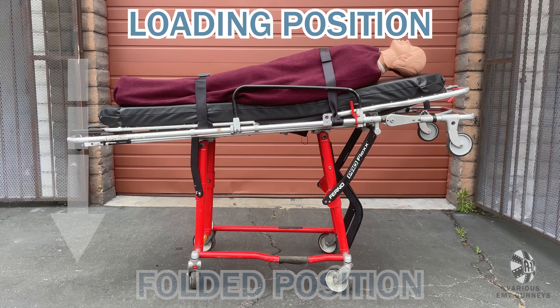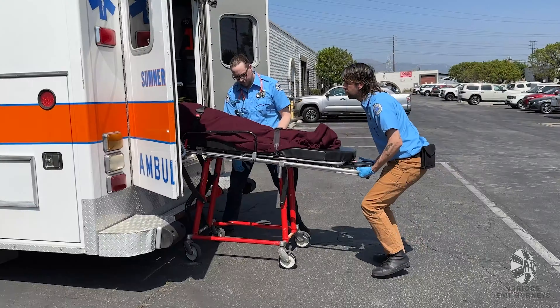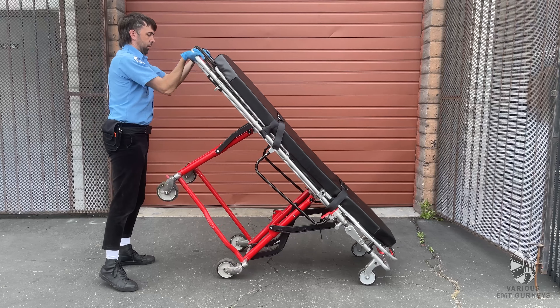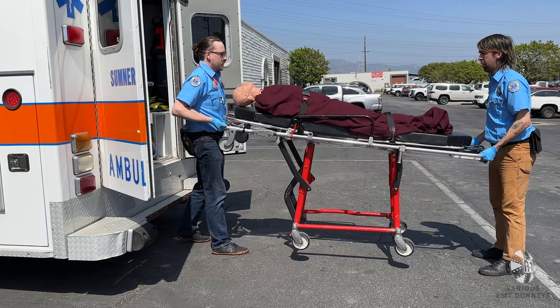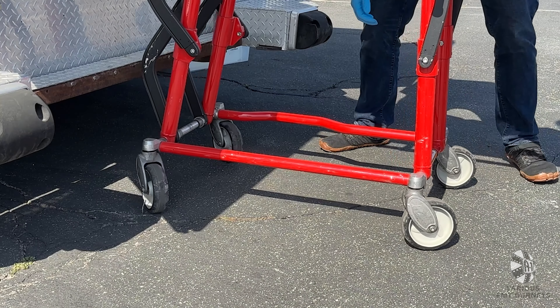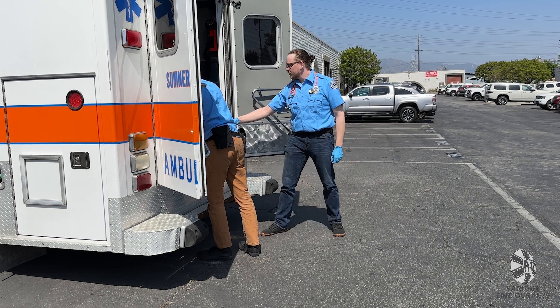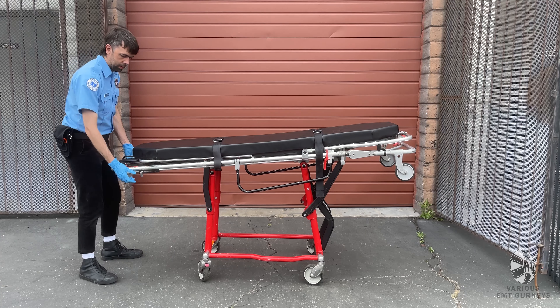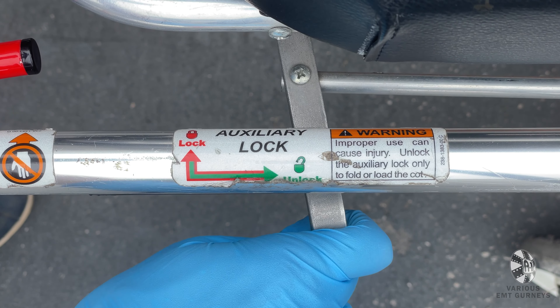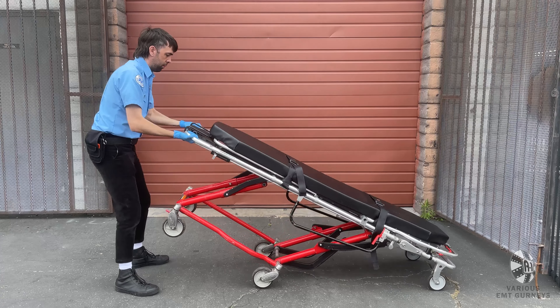In order to switch to the folded position, you will need to start in the loading position, and you will either need an ambulance or you will need to fold it solo. To load into an ambulance, raise the gurney to the loading position. Place the loading wheels inside and make sure that the auxiliary lock is disengaged. Squeeze the lever and lift the foot end until the transport wheels are off the ground. Have the other person pull up on the lifting grip and help push the gurney into the ambulance. To fold the gurney by yourself, start in the loading position. Grab the frame with an underhand grip and make sure the auxiliary lock is disengaged. Tilt up until the loading wheels are on the ground, pull the release lever, and then lower the gurney into the folded position.